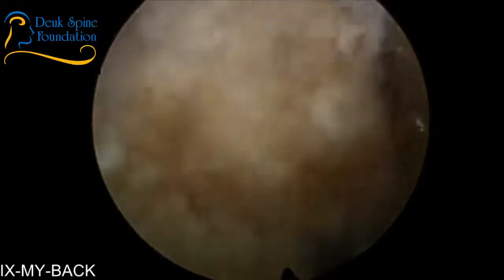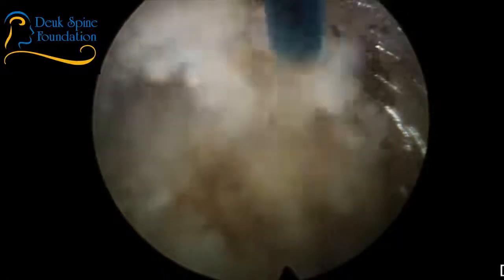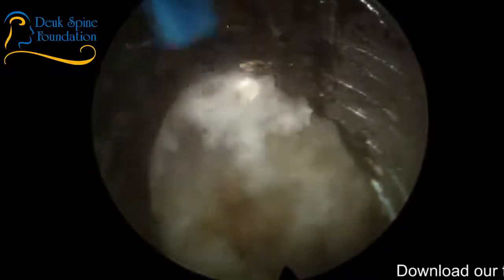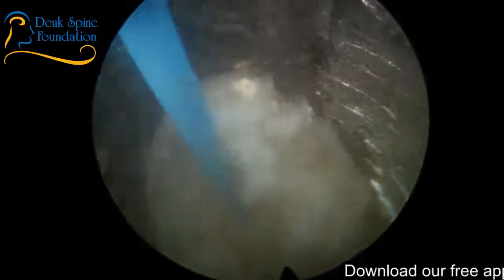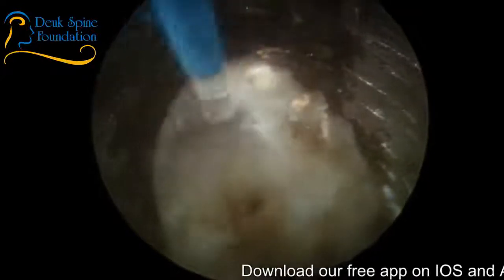Almost done. But because we didn't get to do the dye injection, we don't have any blue. You all notice that? There's no blue. So it makes it harder. Doesn't make it impossible. It just makes it harder.